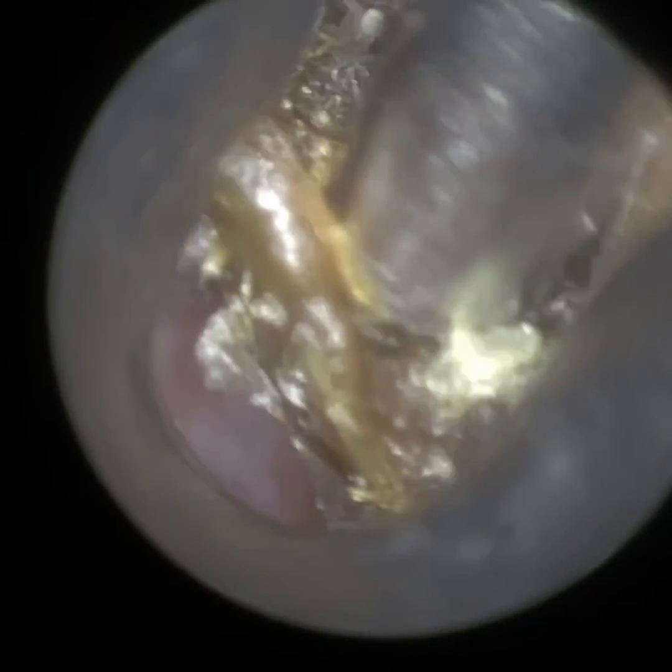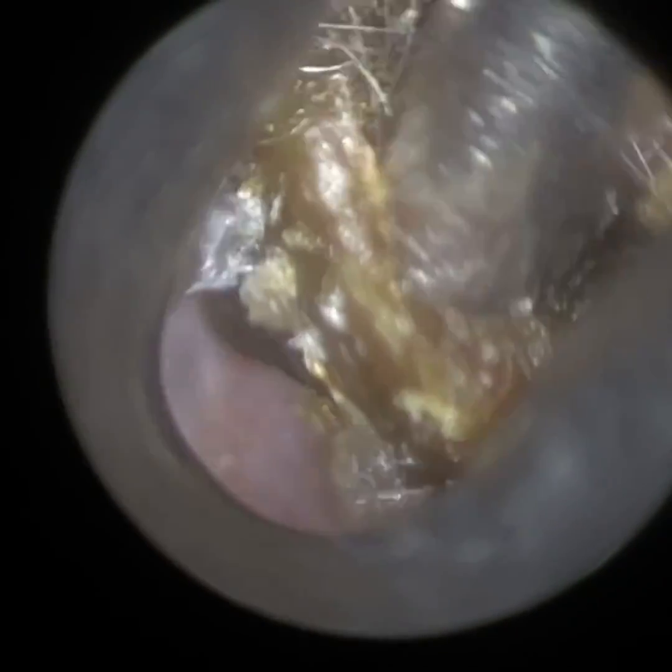So we have a patient here who presented with a really large, hard ball of dry earwax and they have a very narrow ear canal. So I'm using our smallest specular on the Waxscope here, which is a 3.5mm.